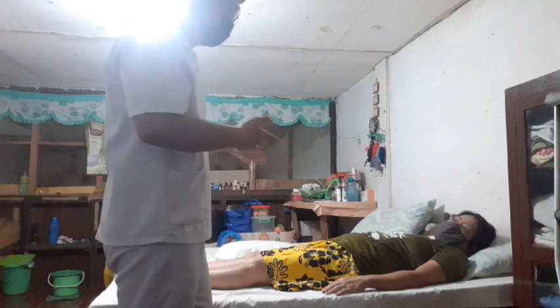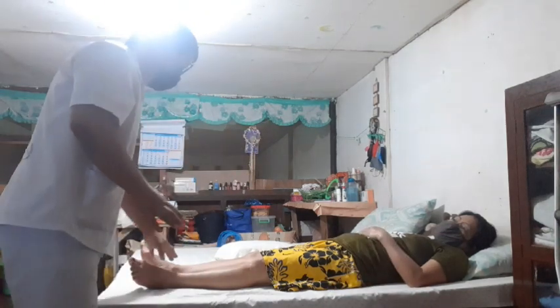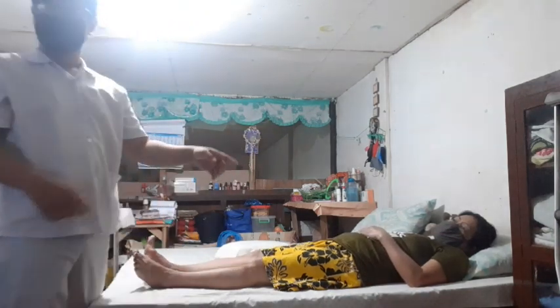For measuring the crutch height, use a tape measure while the patient is lying down in a supine position. Instruct the patient to wear the shoes that he will be using for walking. Measure from the anterior fold of the axilla to the sole of the foot, then add 5 cm or 2 inches to get the appropriate crutch length.